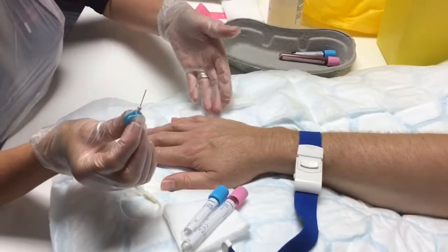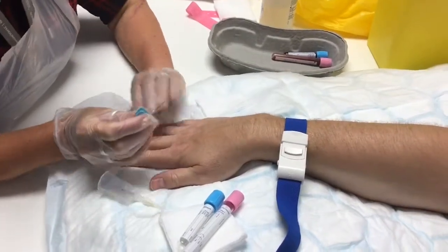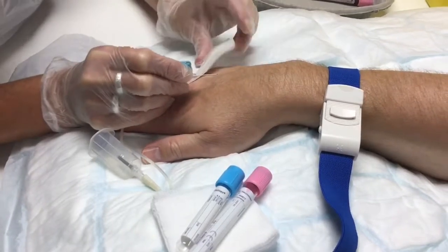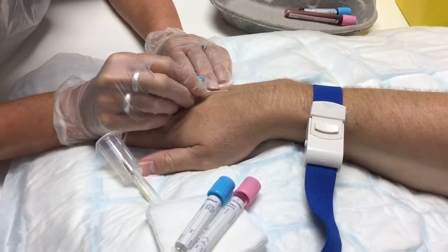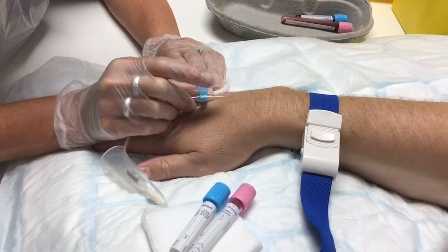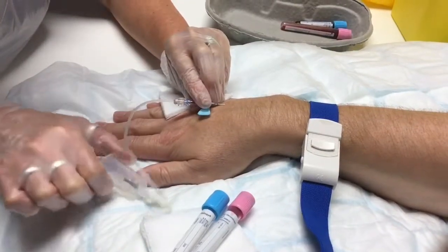Your hand has to be below. I'm just going to hold Mark's hand slightly and rest it there. That looks as though it's air dry now, so it's absolutely fine. I'm going to insert the needle — I'm deciding I'm going to go into that one. Sharp scratch. That's lovely, just insert it along. And you can see again we get a flashback. Don't put the needle all the way in, keep it up at a little angle there.